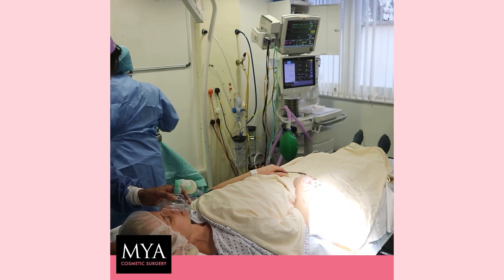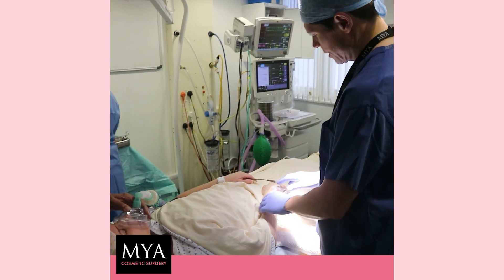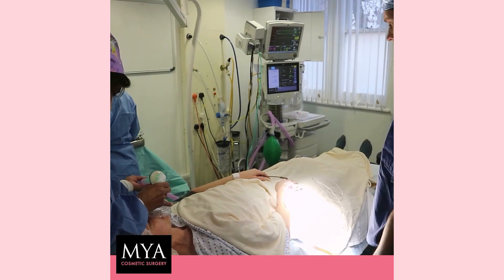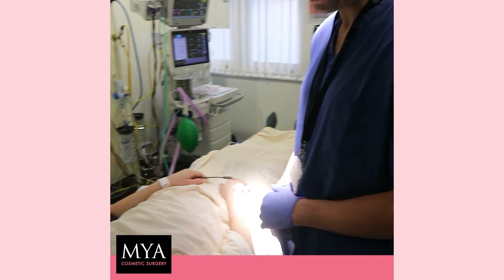Just oxygen. Oxygen to breathe, for safety. Nice deep breath. Nice deep breath. So you might feel a little bit more cold coming up your arm — this is just another bit of medication, the sleepy one.